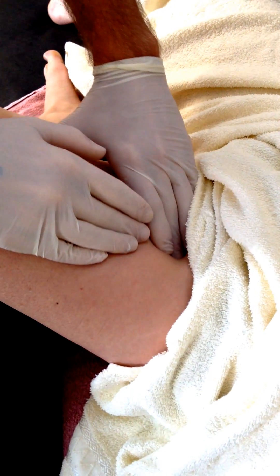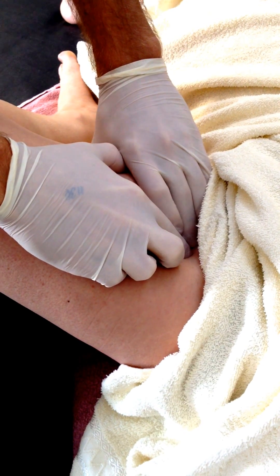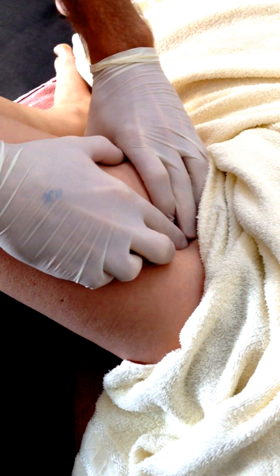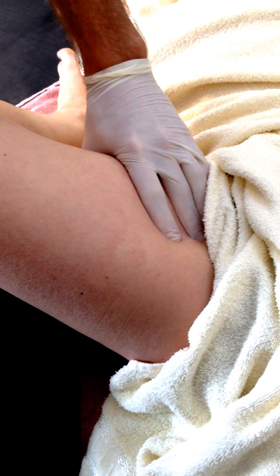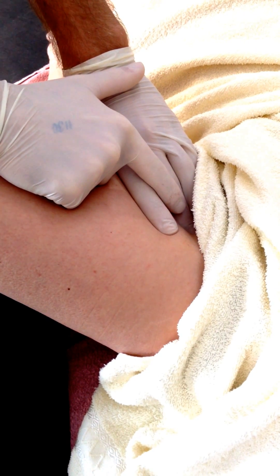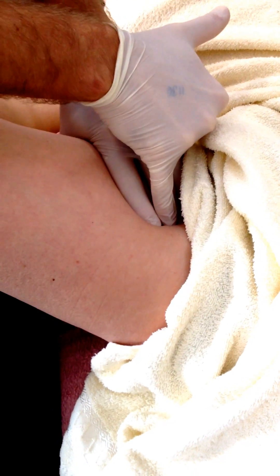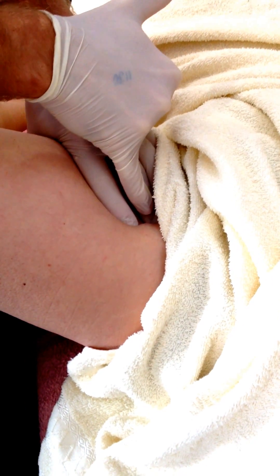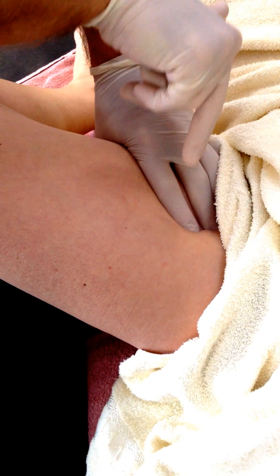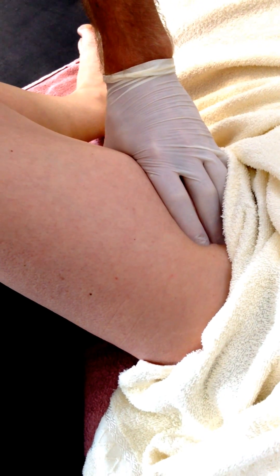Now that I've found that tendon, what I do is I'll come back and find that artery. So the artery's in under my left hand there. What I would do is needle with my right hand, and I'll position my left hand so my index finger is over that artery so I can feel that pulse the whole time, and then I can push everything away with my index finger. The tendon of psoas is between my two fingers, and the artery is under my middle finger, and then I can needle in a lateral direction — to the lateral, anterolateral border of that femoral triangle, away from those neurovascular structures.